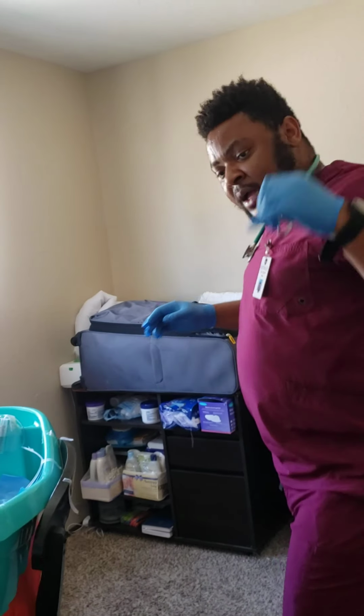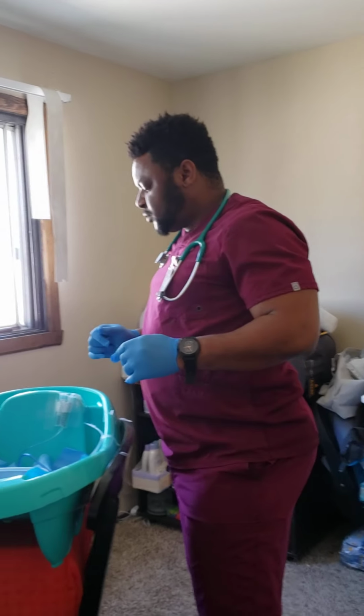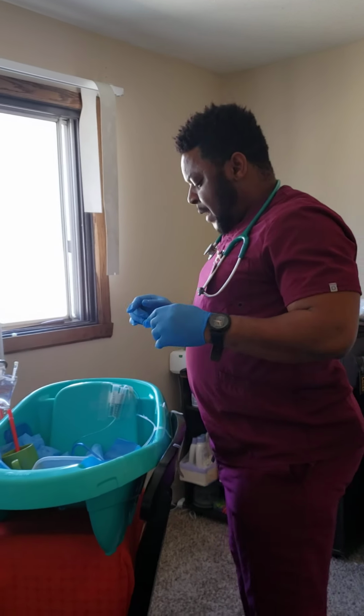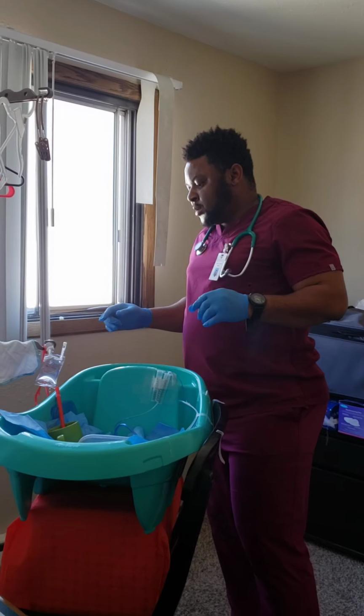Okay. After I have done that, I will then want to connect my patient to the suction machine.